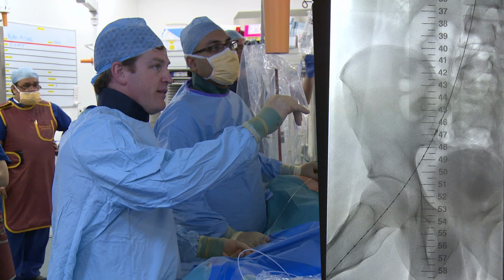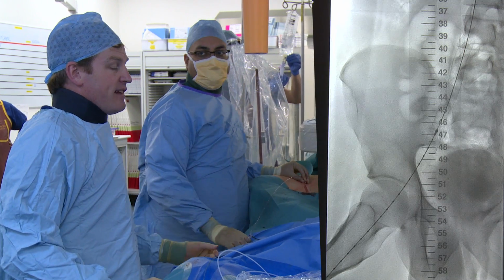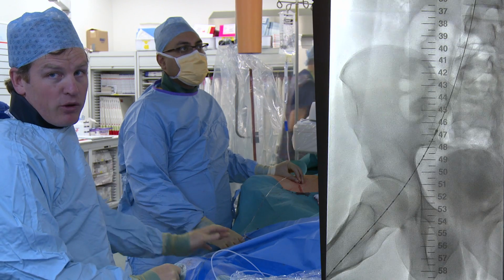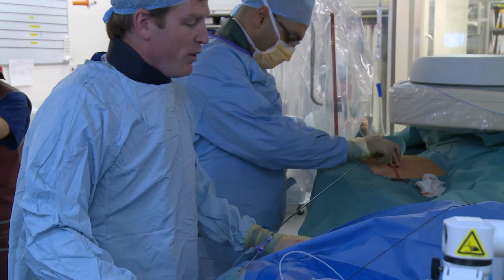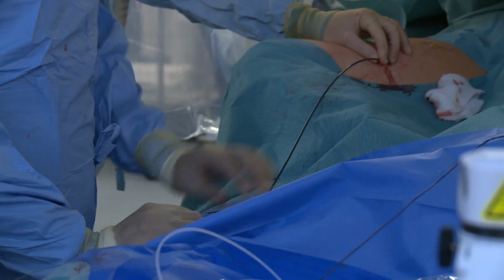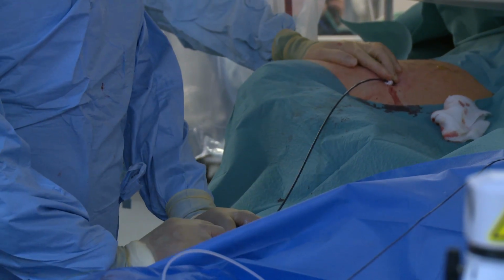The second stent is a 16mm by 120mm stent. The second stent is advanced over the guide wire and into the sheath introducer until the central end of the stent extends approximately 2 centimetres past the peripheral end of the first stent. The second stent is deployed the same way as the first stent.